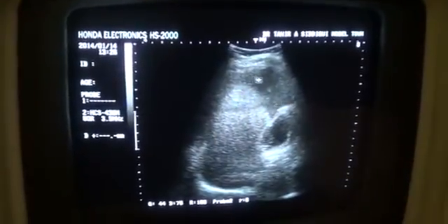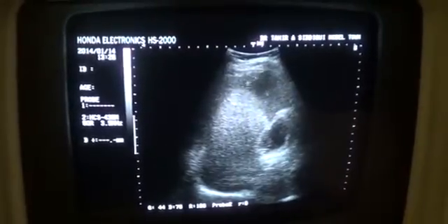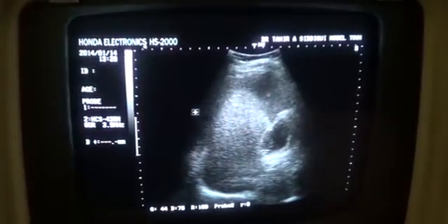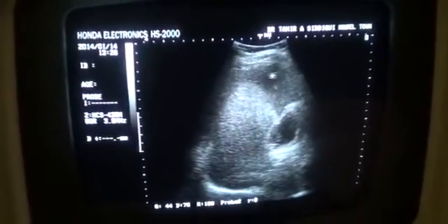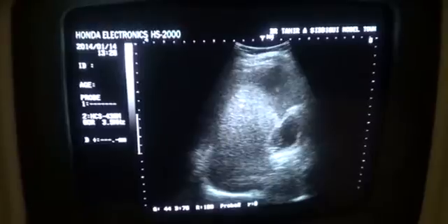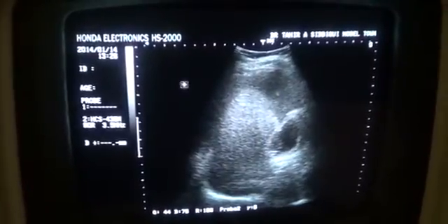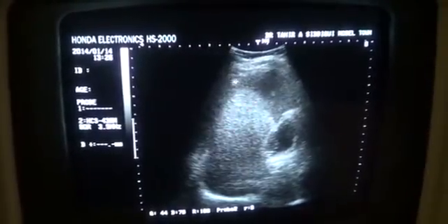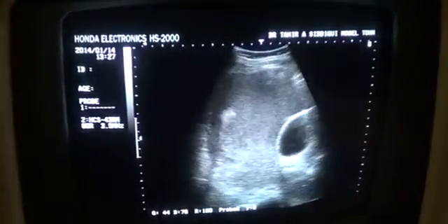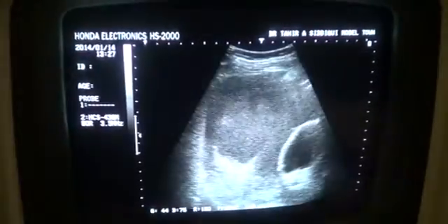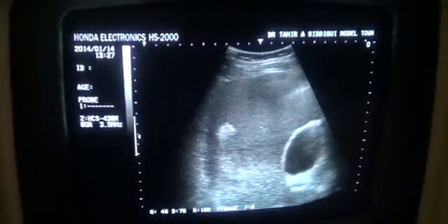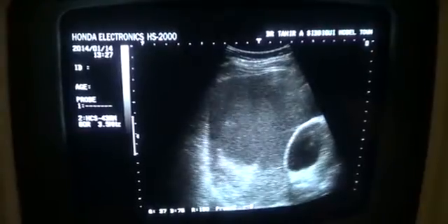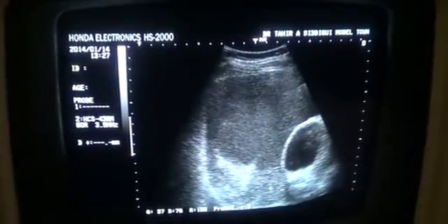This is the gallbladder, and this is the fluid surrounding the outer surface of the liver. Note that in this fluid there are low-level echoes. In routine, without complications, the cirrhotic liver when surrounded by fluid — the fluid appears black. Whereas this fluid is not black but occupied with low-level echoes floating within it.